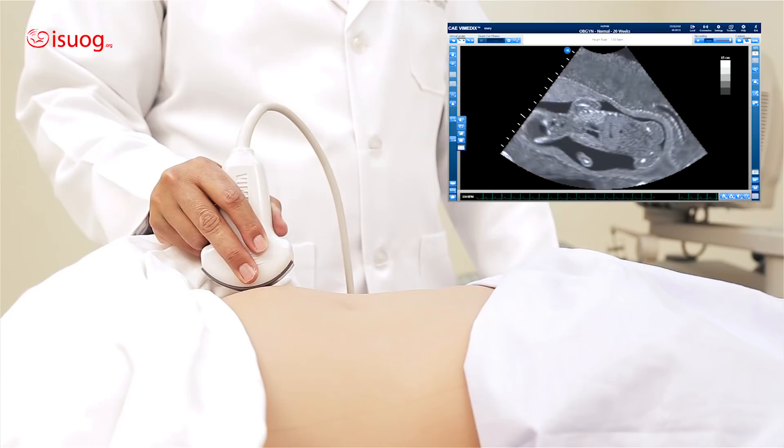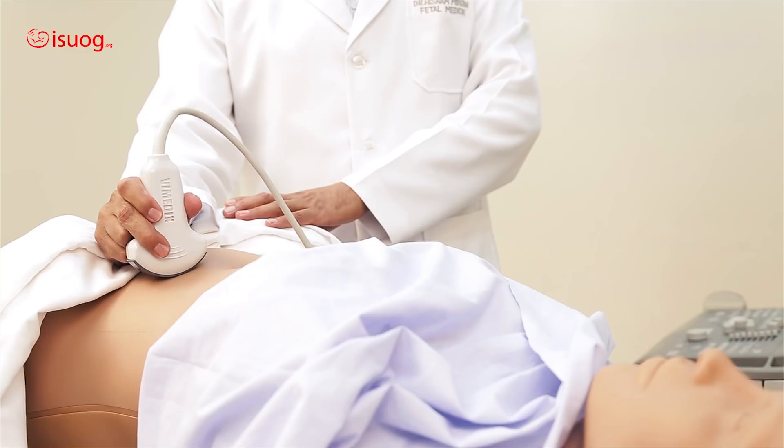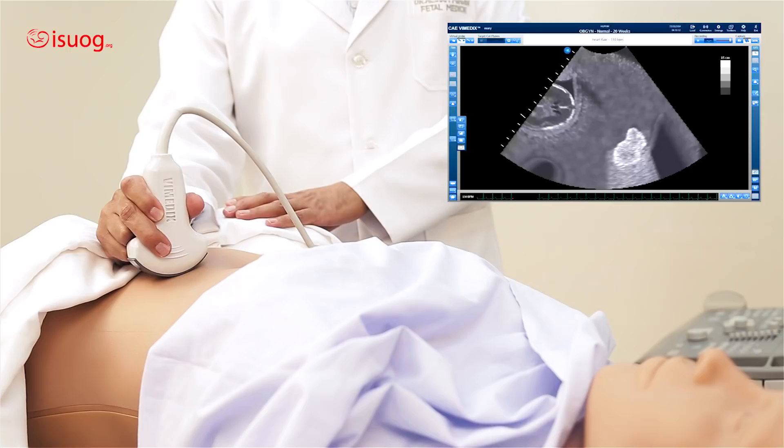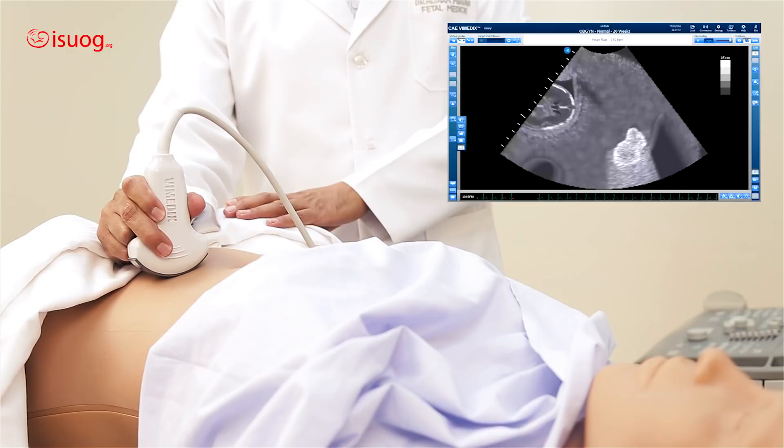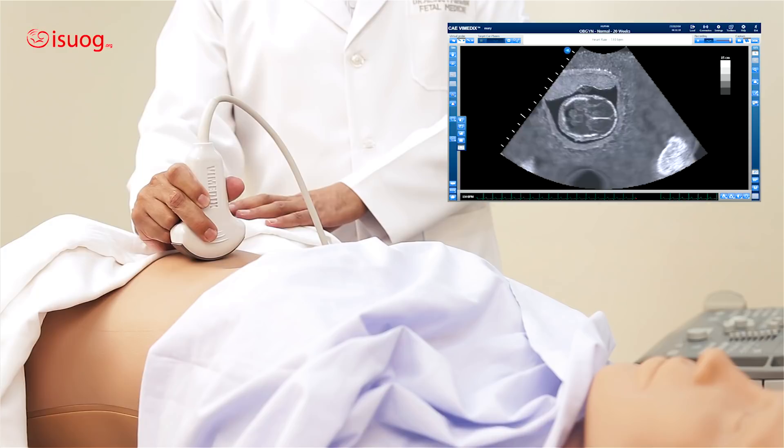Here is another example of sliding on the narrow and what it does for your image. If you look at the screen, we are looking at part of the fetal head, but we want our target — the fetal head — to be in the center of the screen. So we slide on the narrow, and as you can see, your target comes to the middle. Sliding on the narrow brings your target to the middle of the screen.